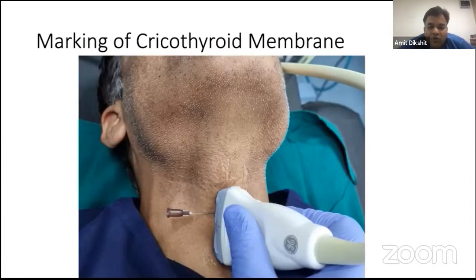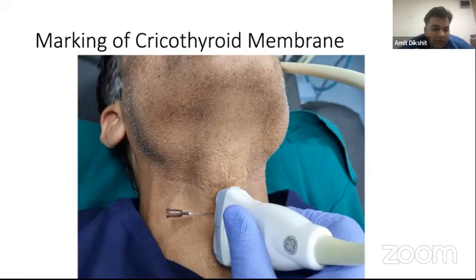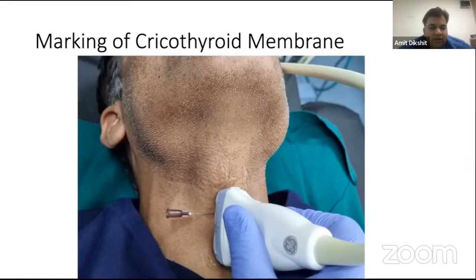Now, what we have learned from experience is when we are called for the cricothyroid membrane, how we are utilizing it. For patients with difficult intubation, say in ICU, with stridor in sitting position, we have done intubation in sitting position. We have prophylactically placed a 16 gauge cannula there. We punctured the cricothyroid membrane with ultrasound, and then attached a 2 cc syringe, and then, as we know, the 6.5 universal connector and Ambu bag. As we have punctured and placed a 16 gauge cannula there and removed the stylet, we have even done some spraying with 2% lignocaine and some topicalization. So as we are able to attach the Ambu to that and do some oxygenation, it has provided us a little additional 10-20 seconds to complete our awake fiber optic intubation drill in sitting position.